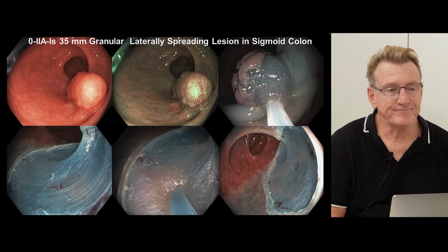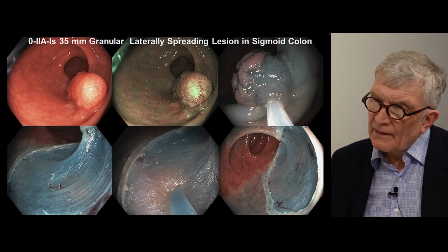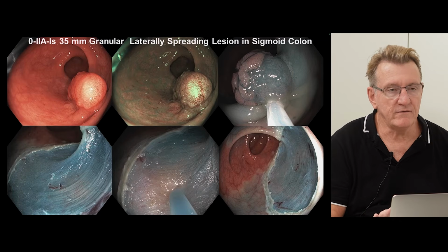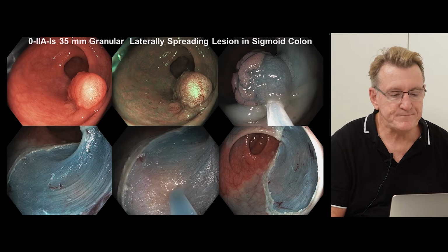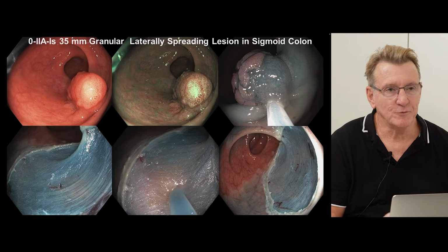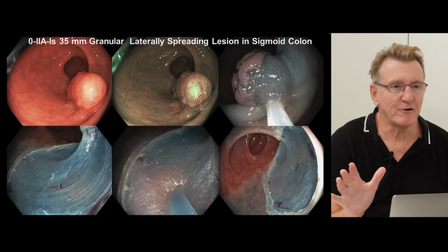Yeah. But the exposed muscular layer, so you're type 1, if it looks nice, it's fine. Fine. You don't have to act on that. Yeah. So okay. Yeah. Good. Yeah. So that's normal. 0 and 1. 0 and 1 are normal. Yes. Yeah. Okay. You don't see 1 so often. I mean, you most commonly just see 0 all the time.